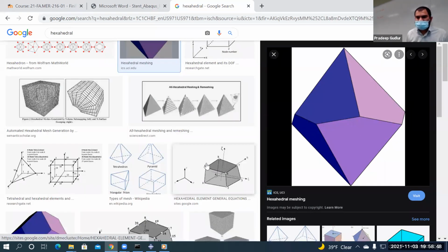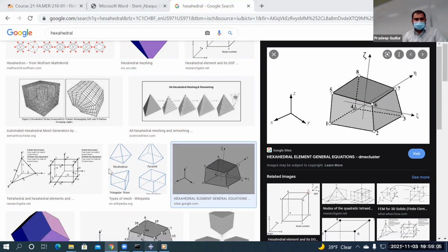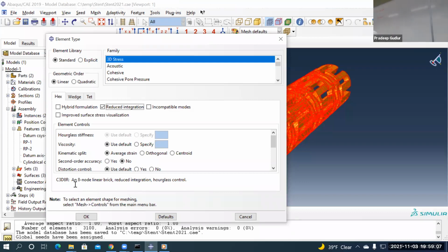It's not exactly a cube. So that's a hexahedral element: 8 nodes similar to a cube, but lengths are not exactly equal and the surfaces are not exactly perpendicular. So 8 nodes you should expect. And that's the problem. It can't use the hexahedral element for this geometry. We'll get an error and we'll come and fix it. Say okay.